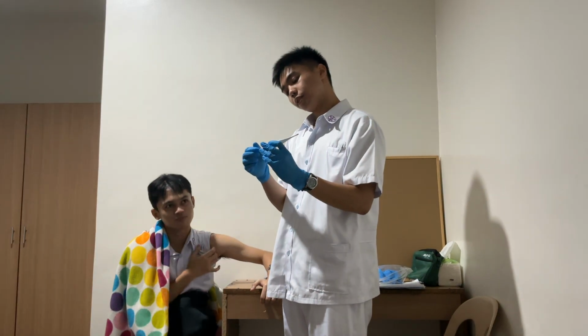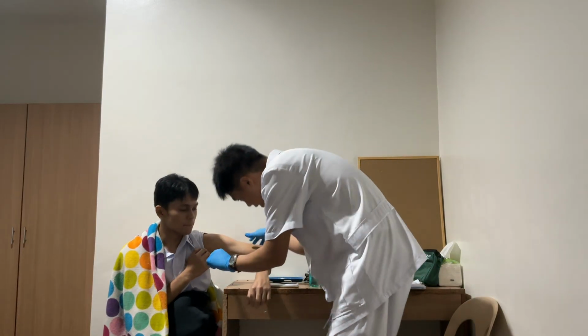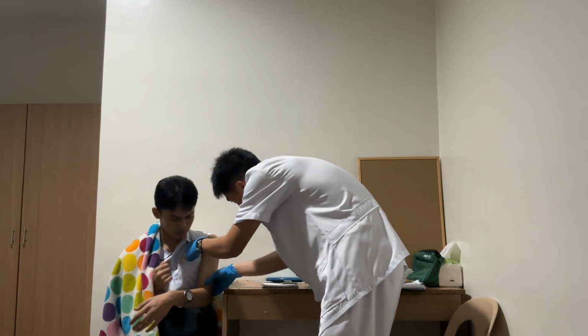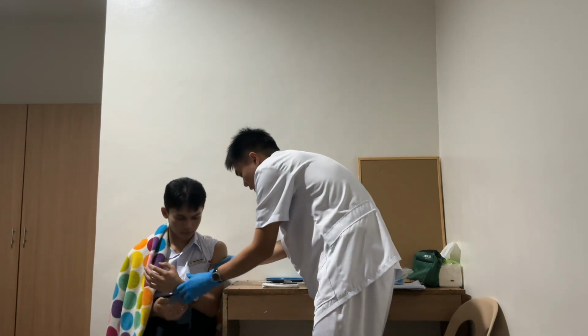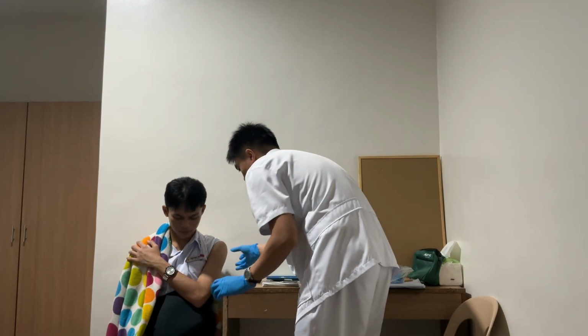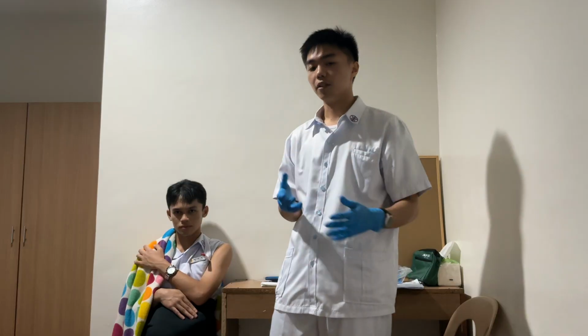Then, once that's turned on, I am going to insert this now in the mid area of the axilla. So, mid area. Then, ipit lang po natin siya, ma'am. And then, arms crossed. So, with that, we're just going to wait until the thermometer makes the sound or indicates that it is already done.